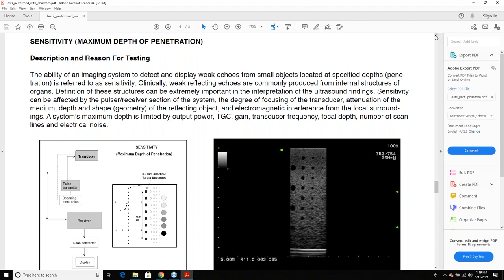And it becomes less subjective. If you can't see the object, if you're saying, I think that's it, it's probably not worth recording, right? We're not here to try to wonder if that's the object or not. If you can't definitively tell me it's the object, then don't record it as that. Otherwise, the next guy comes in, he records it as something completely different, and now you look like you have degradation over time, right?